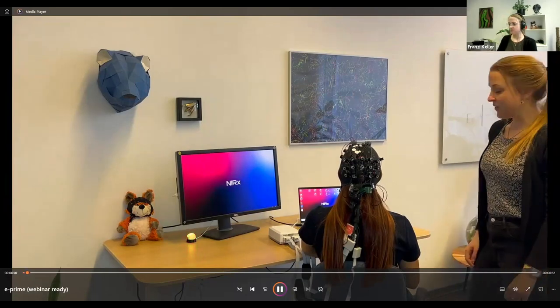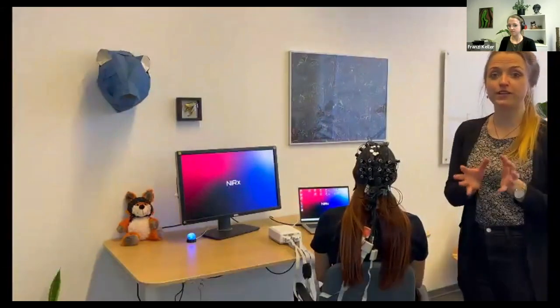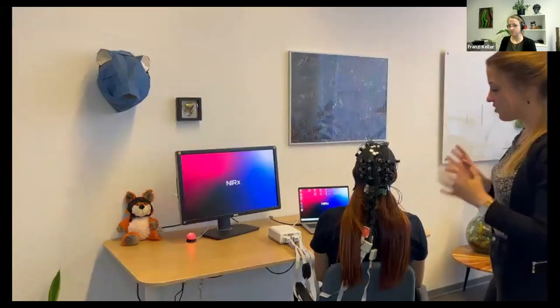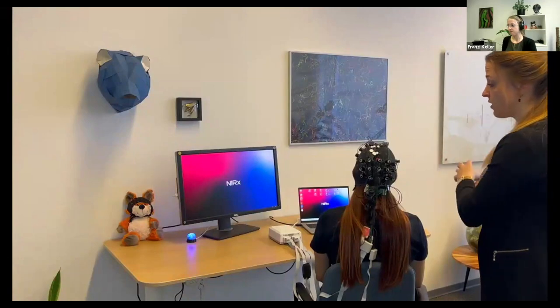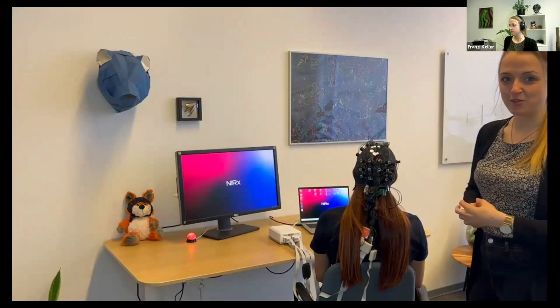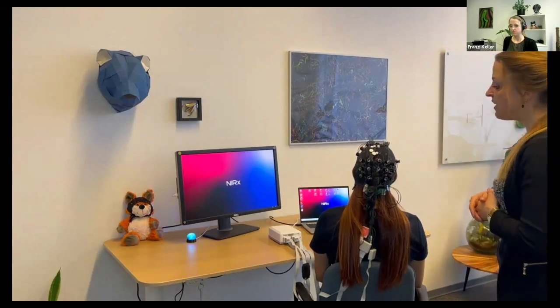Hi everyone, and welcome to this last part of the webinar. So I'm going to show you now what we heard in theory and practice. The goal of this video is to show you the full integration of the NIRx extension for E Prime in an experimental setup, meaning I'm going to show you how to start up the software, do the signal optimization, and do the data recording. For today, to show you something different than our usual finger tapping paradigm, we have chosen a visual checkerboard experiment that is pre-programmed in E Prime.